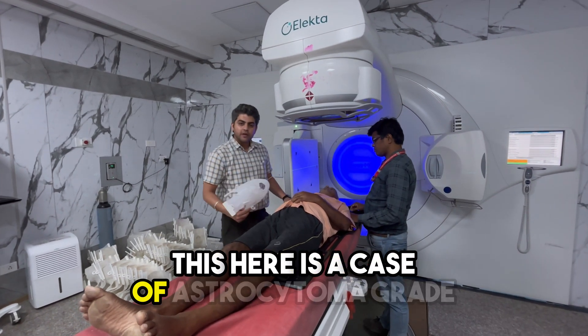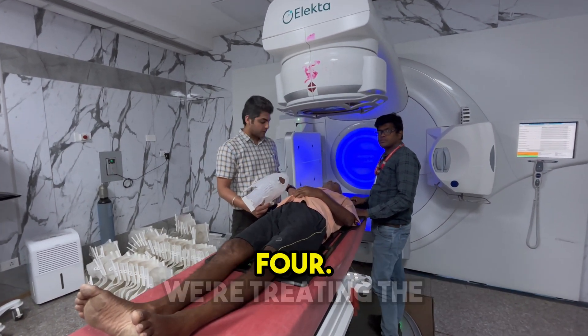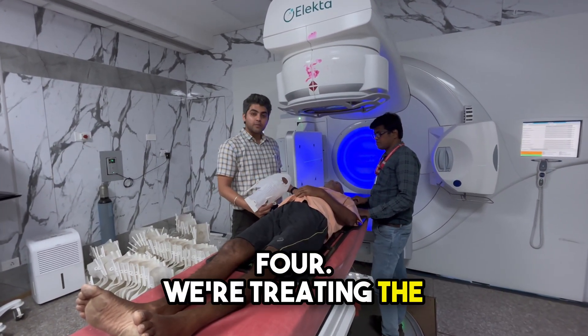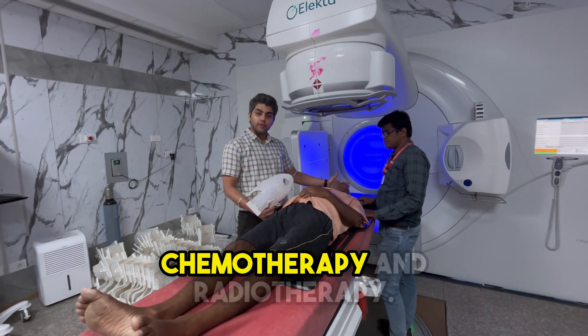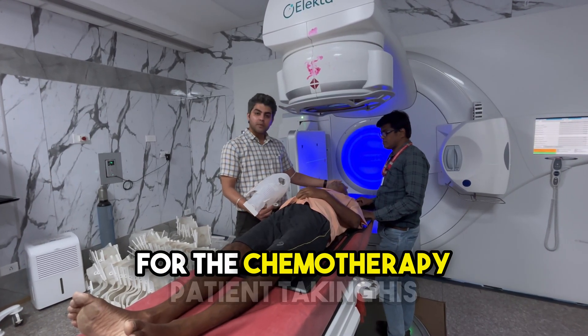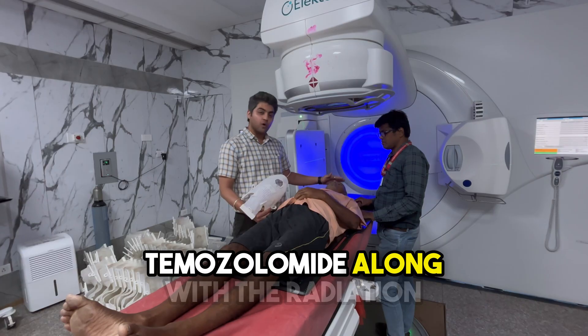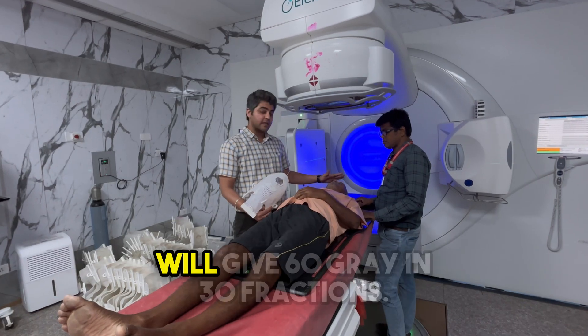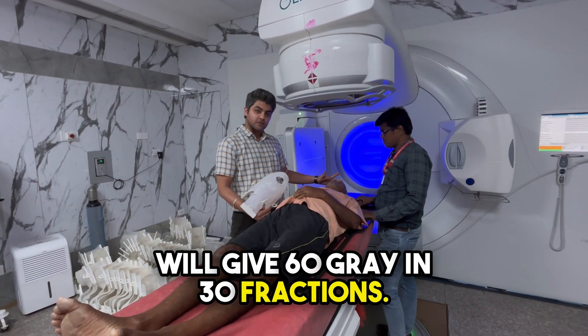This here is a case of astrocytoma, grade 4. We are treating the patient post-op with concurrent chemotherapy and radiotherapy. The chemotherapy the patient is taking is temozolomide, along with the radiation. We will give 60 gray in 30 fractions.